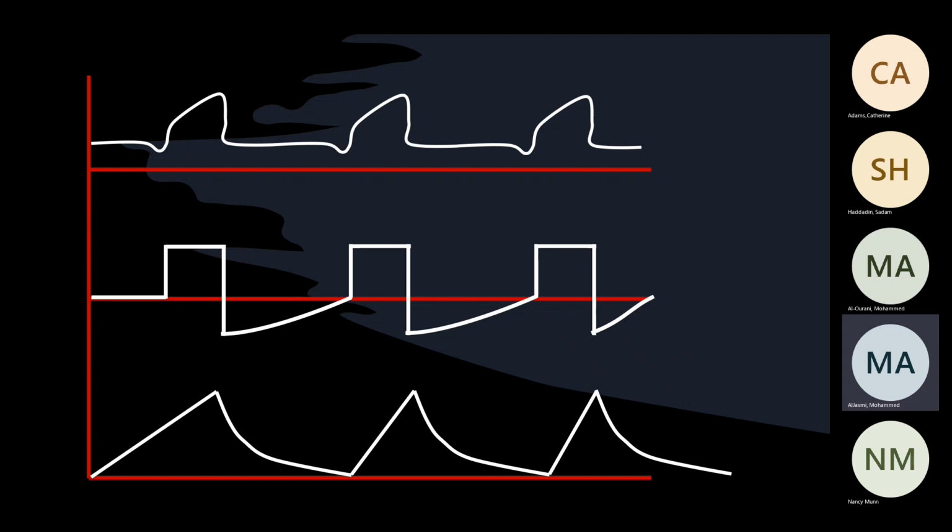To me, it looks the same. The shape for the volume, the pressure looks all the same to me. Not the pressure, because the volume looks different. It's volume control, so the volume should not look different. Is that right? And the flow is constant. Yeah. So to know if it's spontaneous, or if it's intermittent or not.